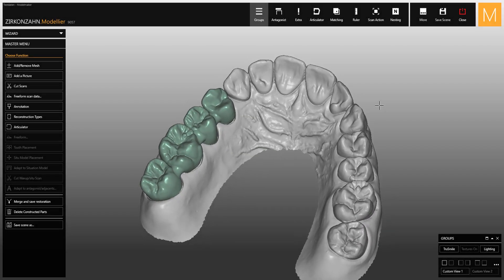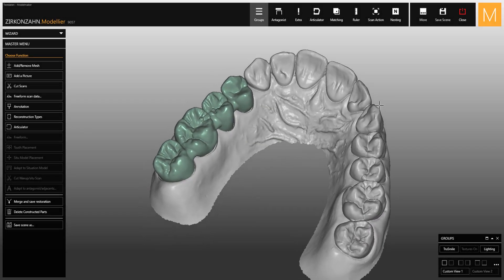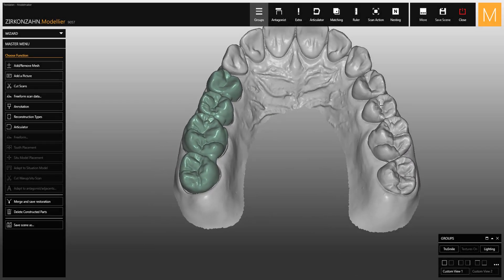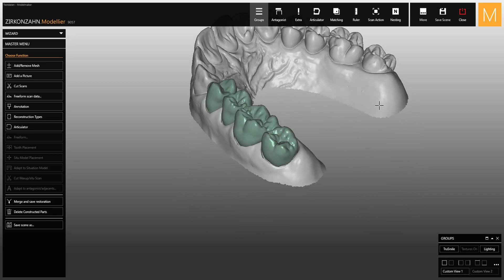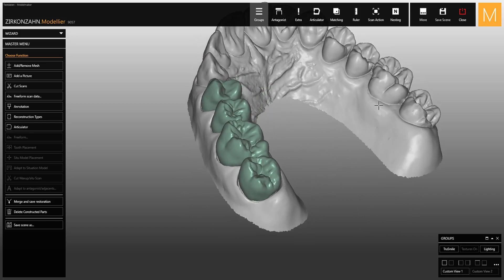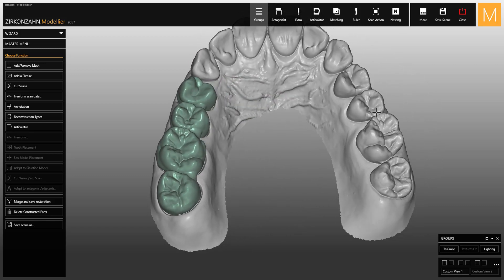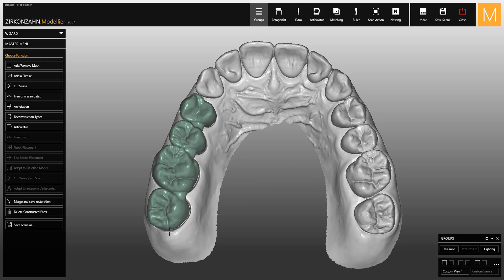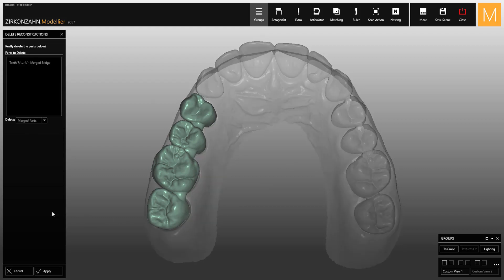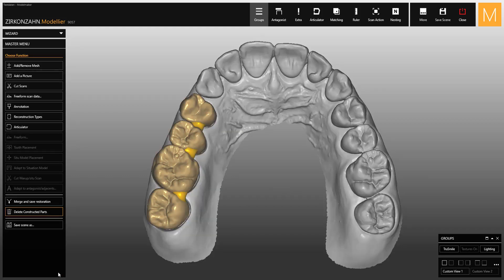After scanning or designing the try-ins, you can import them directly into the existing finished project without having to create a new one. First of all, select 'Delete Constructed Parts' to delete the merged parts. In this way you can change the design.